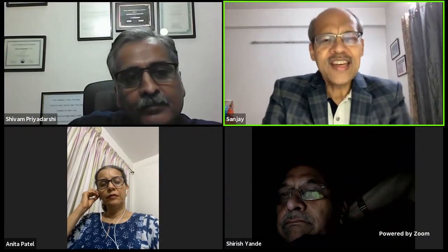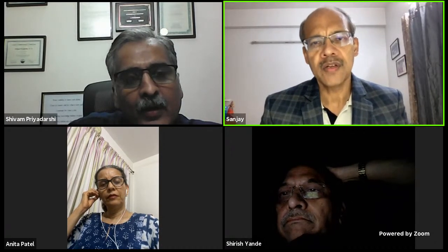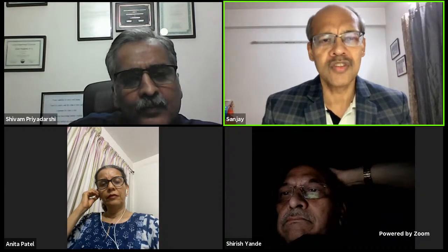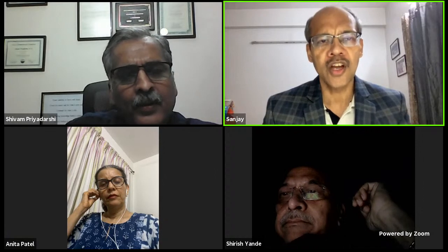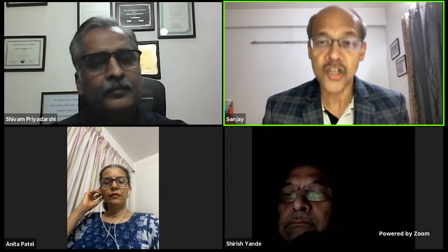Yes. The thing is, most of these are applicable to men rather than women. And the information that you get is, at this point, I don't think it's really good enough. You don't have good clinical correlation and so on. For the high risk groups, where you are looking at safety and so on, I get a feeling that at this point we are just not there in terms of non-invasive pressure measurements.